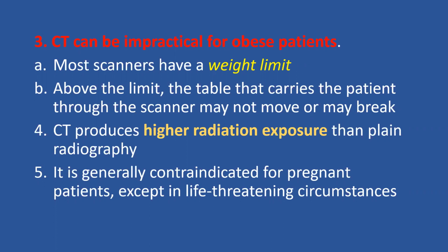CT produces higher radiation exposure than plain radiography. As a matter of fact, CT provides the highest radiation. That's why I was very upset with the mass of this 1-year-old child. We know that these younger children, when they're exposed to radiation, have a higher incidence of leukemia. It is generally contraindicated for pregnant patients, except in life-threatening circumstances. If you have a woman who's pregnant, involved in a car accident, and has a severe trauma, you have no choice. You have to do a CT, then you're allowed to do it.